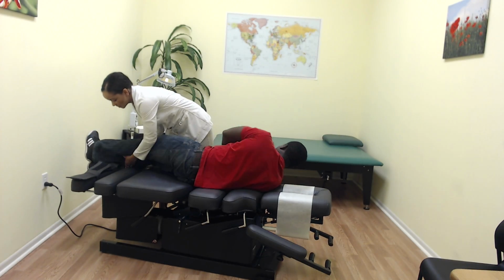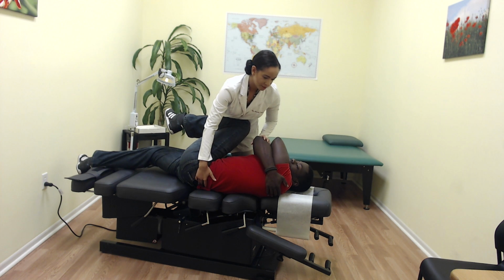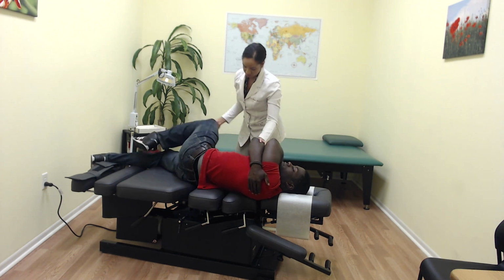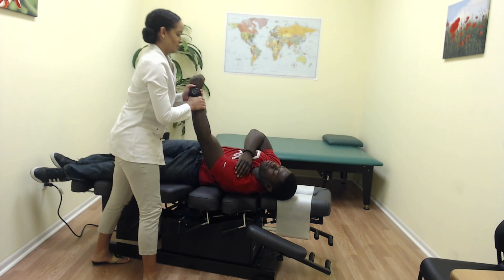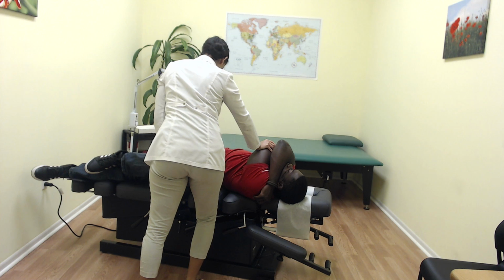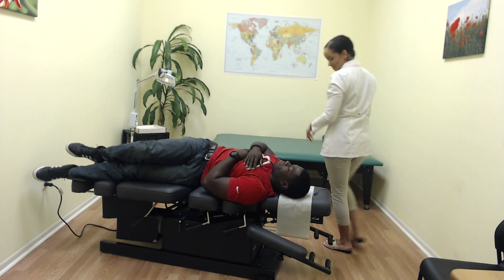Okay. Move your legs back a little bit, right there. Bend this knee. Good, perfect. Shoulders okay there? Good. Take a deep breath in. All the way out. Okay, go ahead and roll on your other side. Do the same thing here. Relax your shoulders. Okay. Deep breath in. All the way out. Super stiff. You should come to your chiropractor more often.